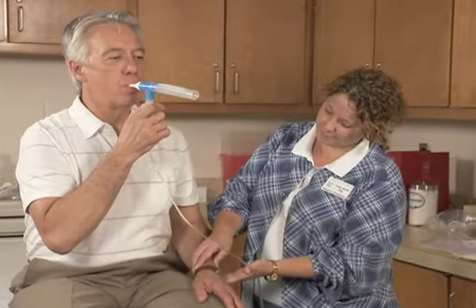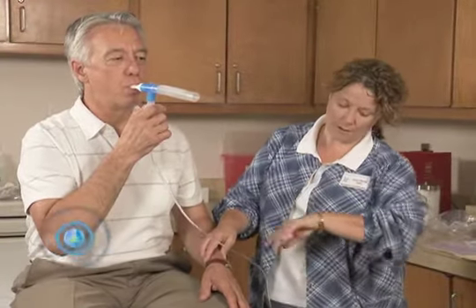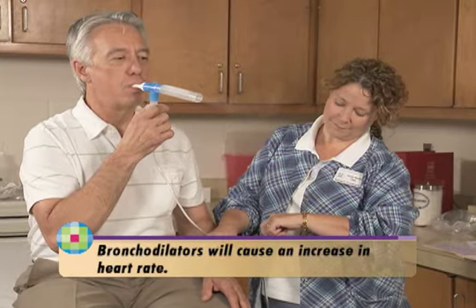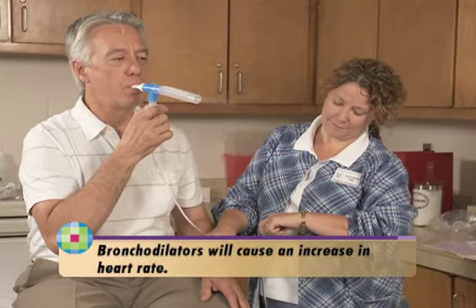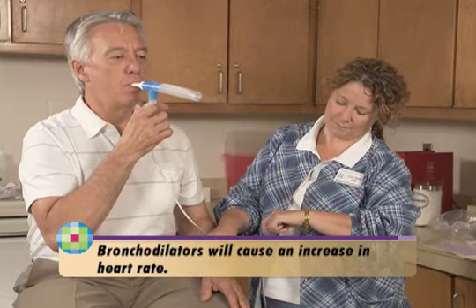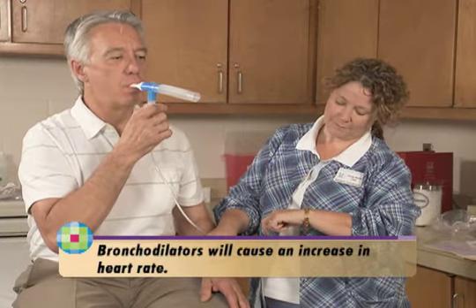Before, during, and after the breathing treatment, take and record the patient's pulse. Most bronchodilators cause a slight increase in heart rate. Notify the physician if the increase is significant or if the patient has other symptoms such as dizziness.